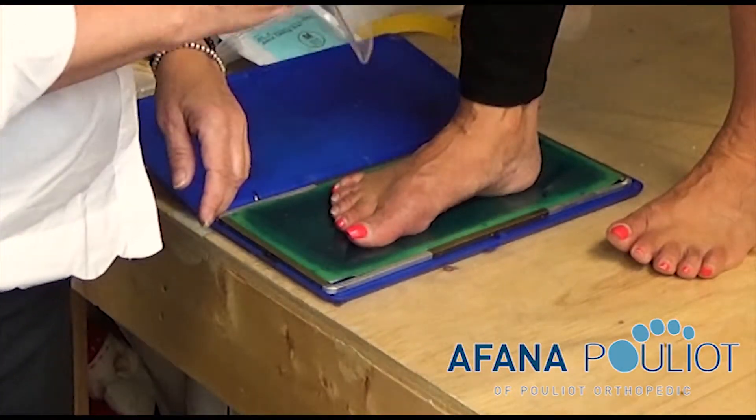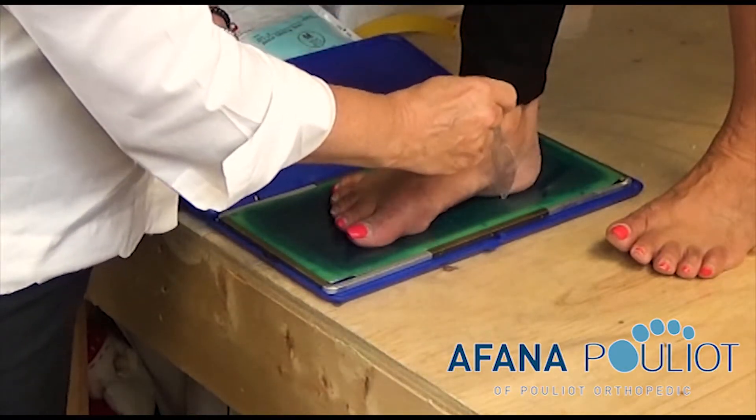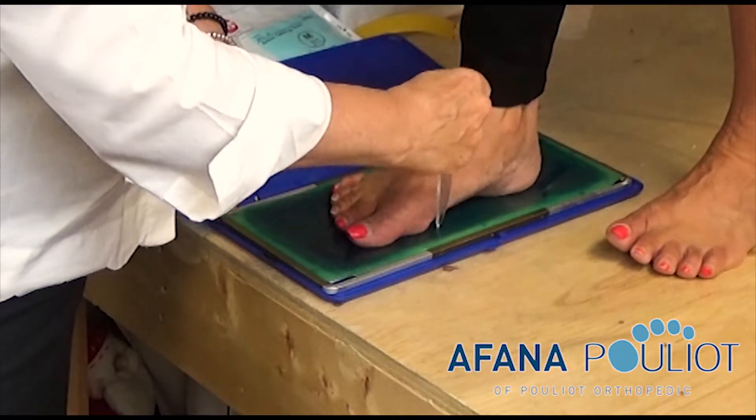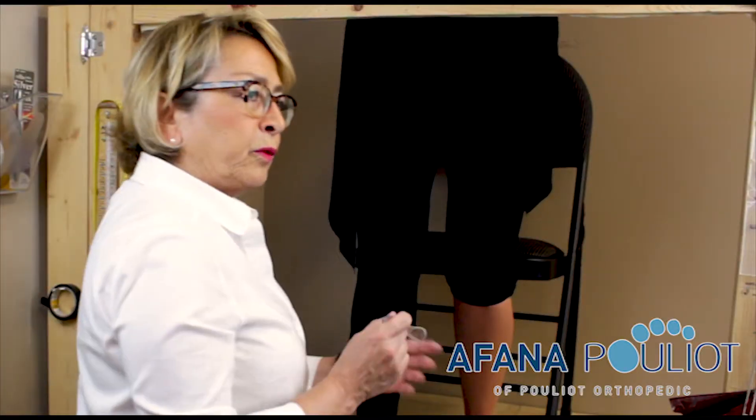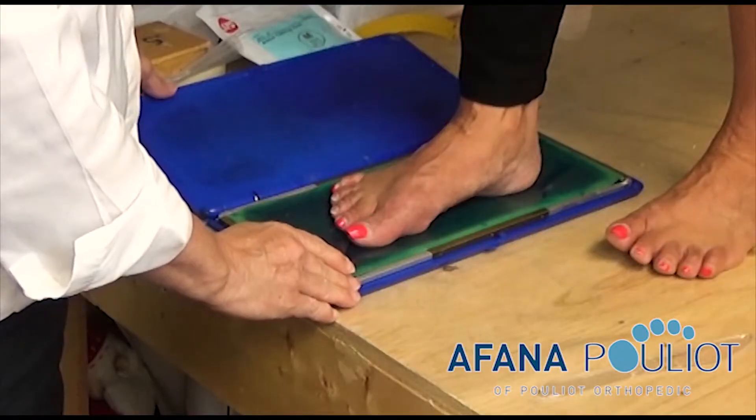Once you've done the contour of the foot at 90 degrees, you come in at this point at a 45 degree angle in the arch, so that we know and we see how much arch height we might be dealing with.